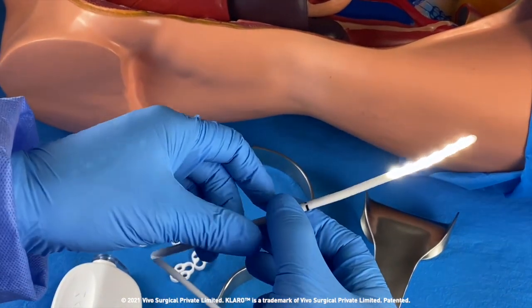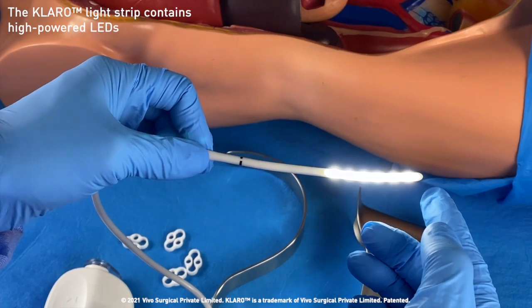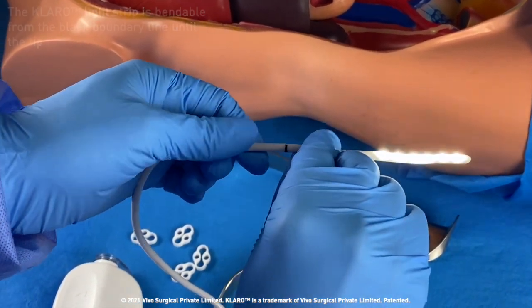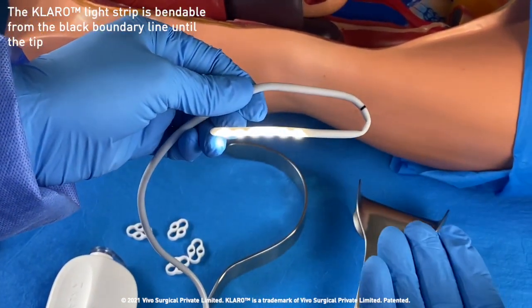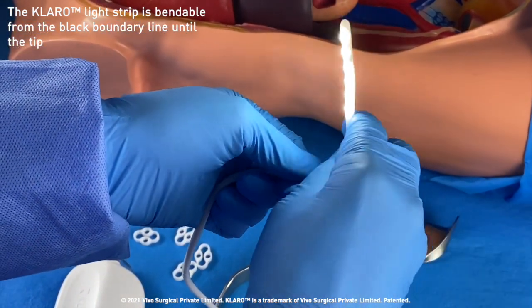Let's take a closer look at the Claro light strip. It is lined with high powered LEDs for optimal brightness. Claro can be bent at any point from the black boundary line to the tip. Claro's light strip can be bent fully forward, even backwards and back to its original position.